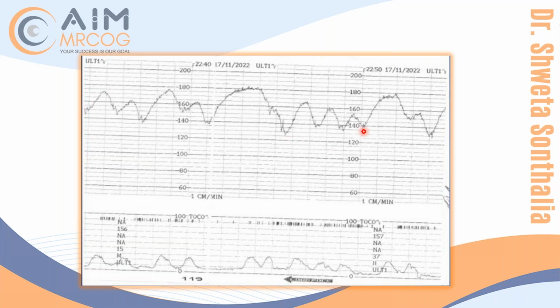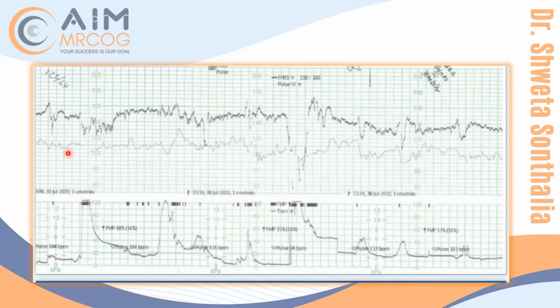But some might say that it is 140 baseline and acceleration. Isn't it? So that's the difference. Correct. Once you understand things well, you can easily pick up that it's abnormal. Okay, what about this one? Thank you, Maya. Very nice. Thank you so much.